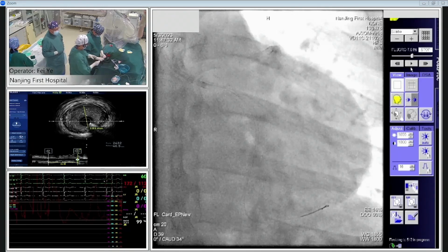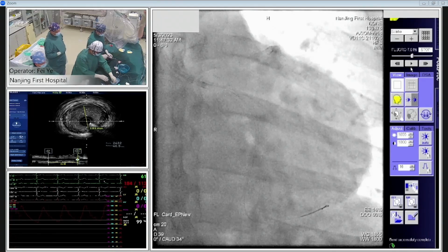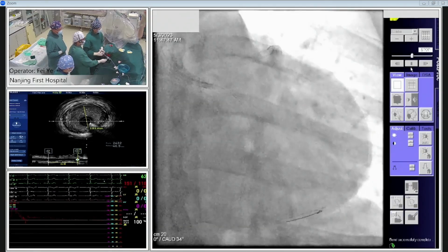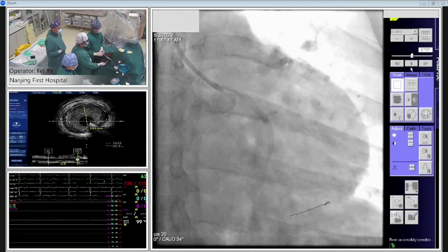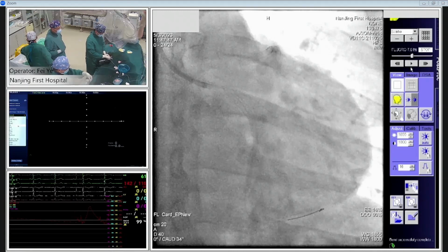When you pull out the NC balloon, because you use the NC balloon, the profile is big. The operator should be very cautious. Otherwise the guiding tip goes in too much and causes proximal stent damage. Sometimes we should pull the guiding catheter a little back when we pull.